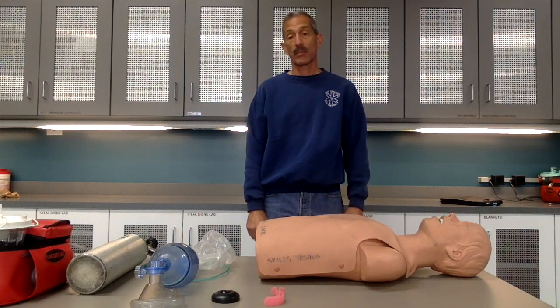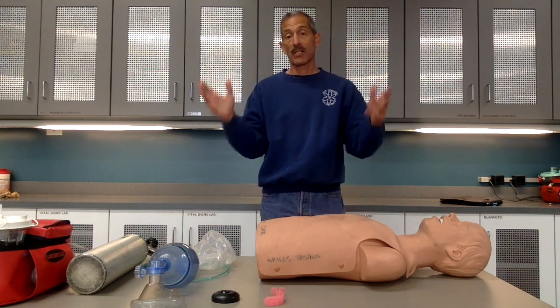This is the BVM skill for the apneic patient. First I want to make sure that I have my BSI on, my safety glasses and my gloves, and the scene is safe.